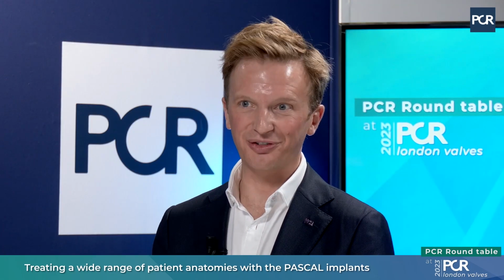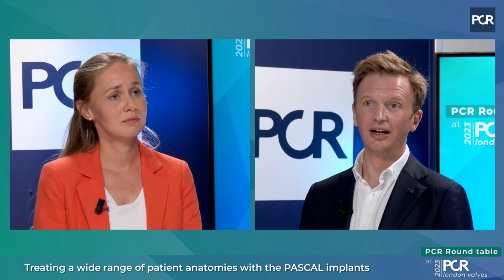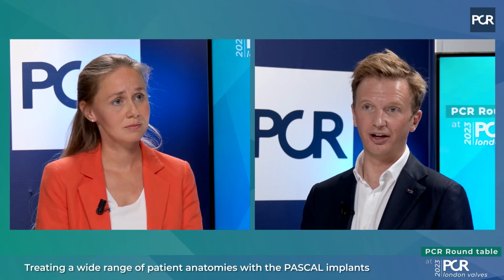So predictability is important, versatility is important, which you very nicely covered there. An issue that's probably the most important is safety. What we see and what we have concerns about in the commissural position in the mitral side and anywhere in the tricuspid valve is that there are a lot of cords. And how does the PASCAL device lend itself to avoiding entanglement and to release yourself if you do get entangled?